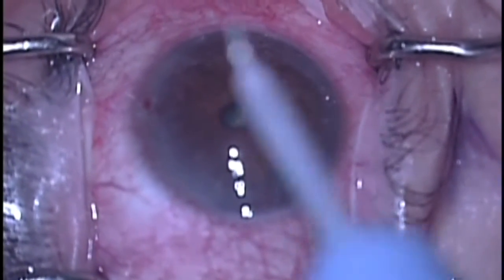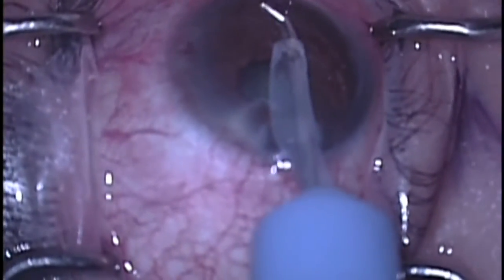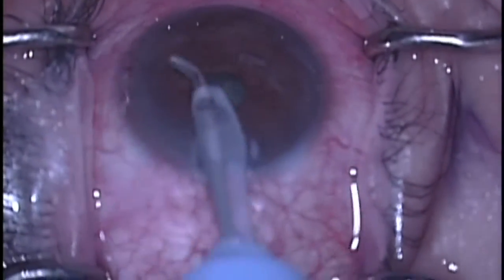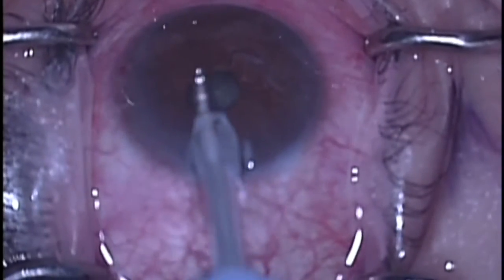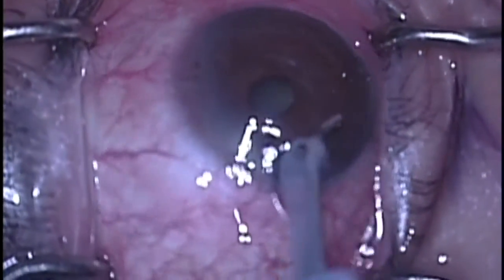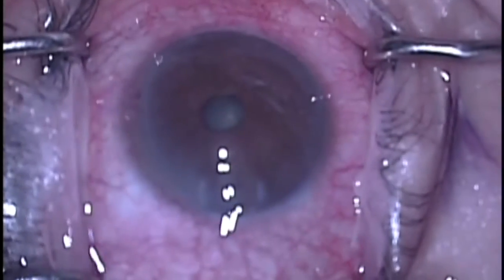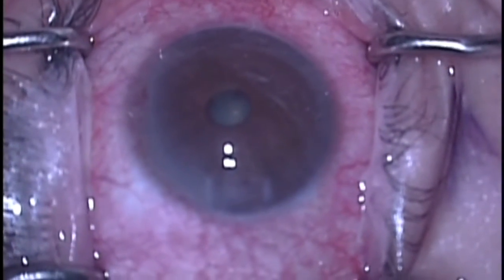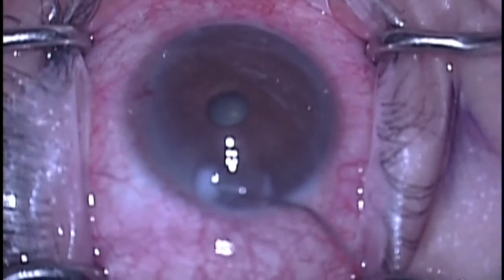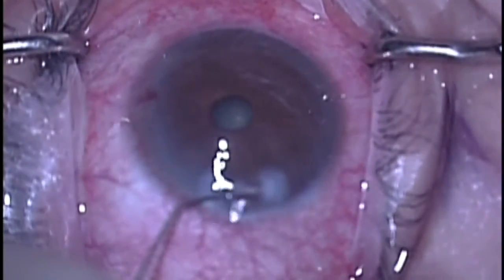As you can see, there is a level of perilimbal blanching of the episcleral vessels. Because of the minimal trauma to the trabecular meshwork, it's very important to remove the viscoelastic from the anterior chamber in order to avoid postoperative pressure spikes. As with normal cataract extraction, the patient's primary wound is hydrated with balanced salt solution in order to provide a self-sealing wound.